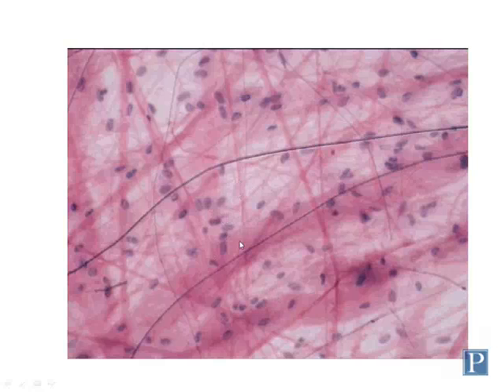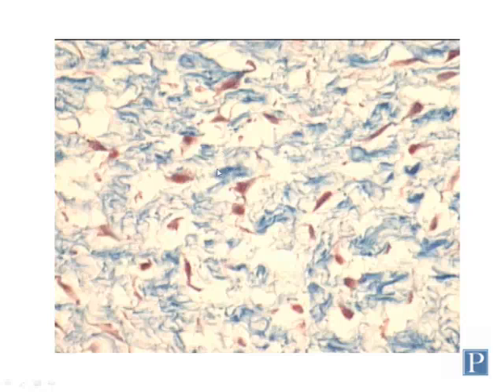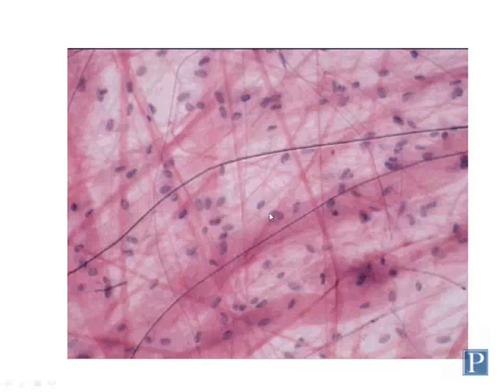You have the collagen fibers, which in this case, because this tissue has been stained with H&E, the type 1 collagen fibers here, these very thick fibers, stain eosinophilic. If you go back in this slide, this is also type 1 collagen, but it stains bluish because it's a different type of stain. You don't need to know the particular stain that was used in that slide. So with H&E though, type 1 collagen appears pinkish.